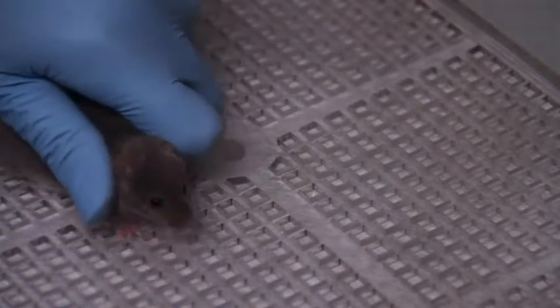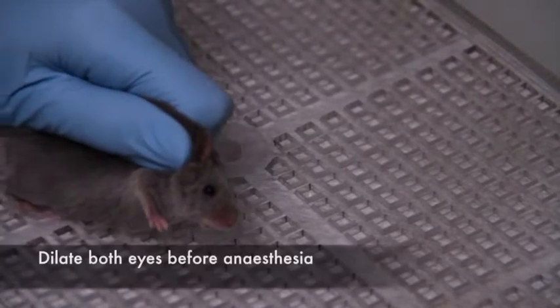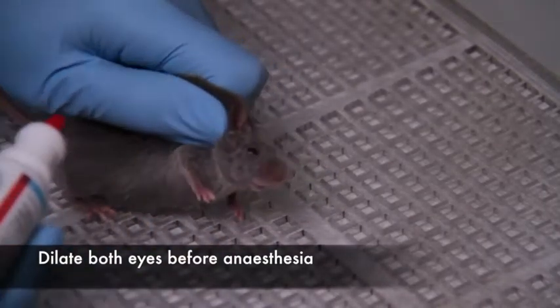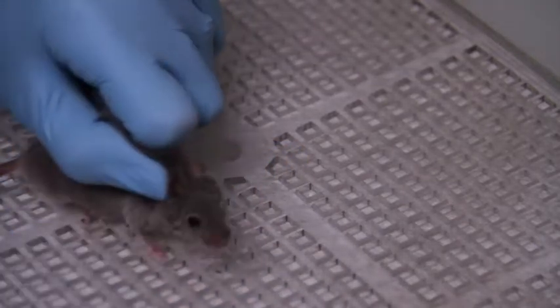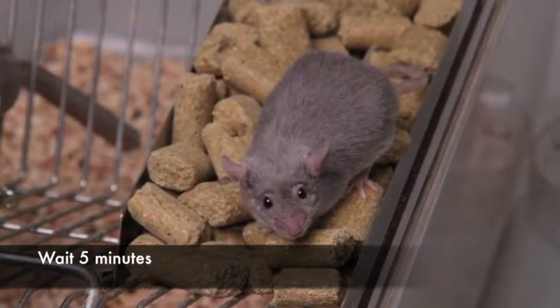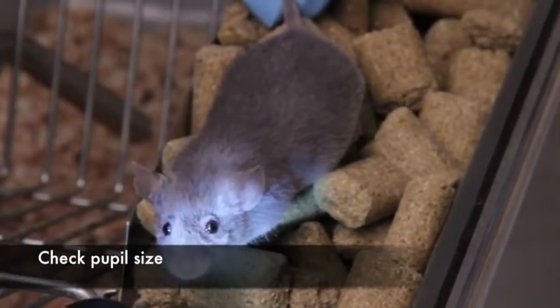Select and scruff your mouse to instill dilating drops before anesthesia. You will place drops in both eyes. Wait 5-10 minutes, and then with a small pen light, check their pupil size.